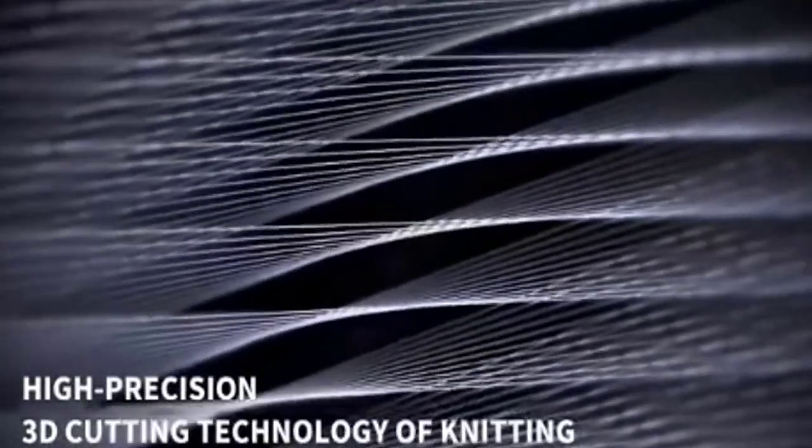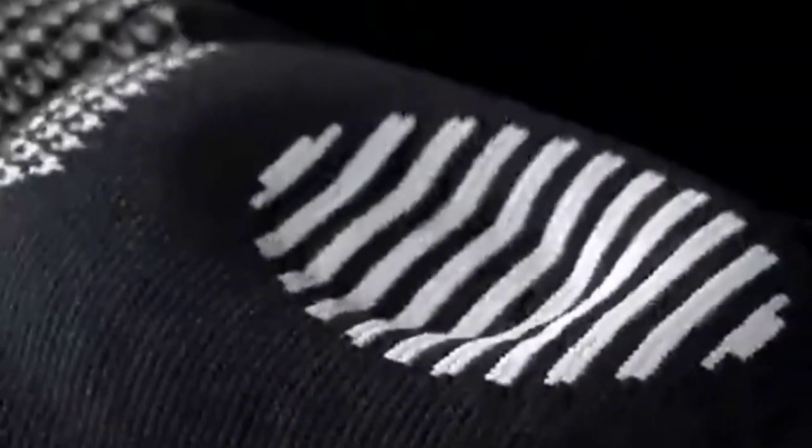Each model was subjected to a punishing quality of tests. Our recommendations are based on our extensive hands-on testing and can help you find the perfect knee brace for arthritis.